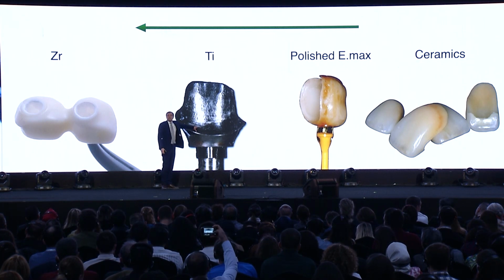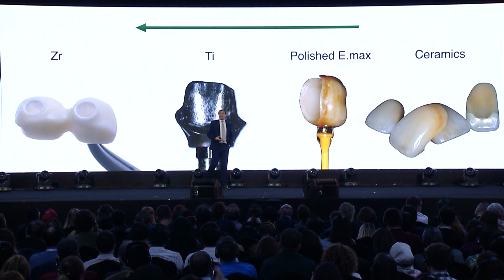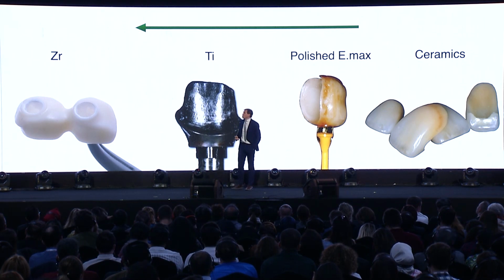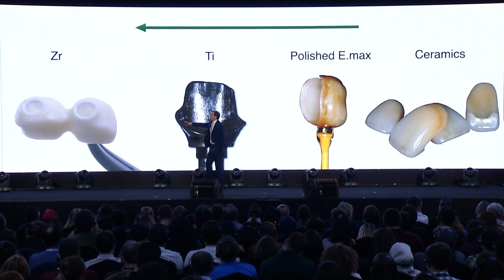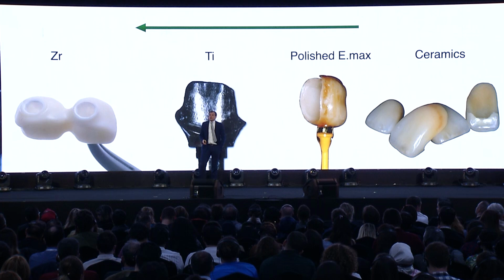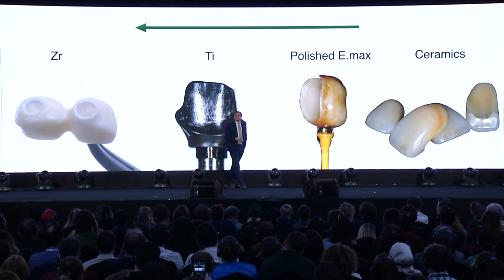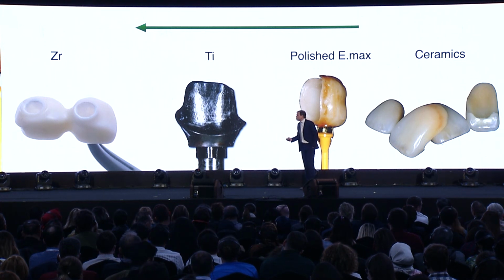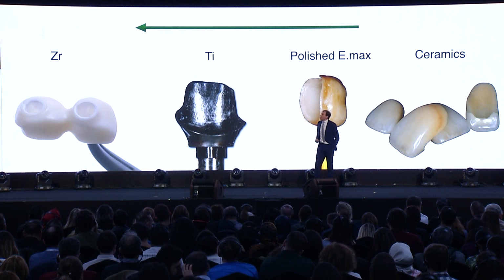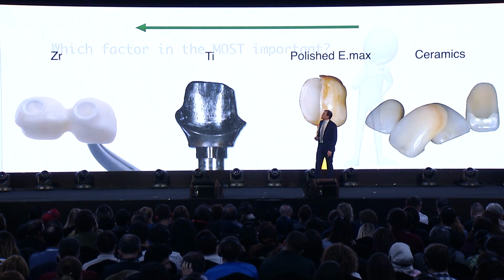Now, what about titanium? Of course, titanium develops adhesion to epithelium. However, it is less strong than adhesion to zirconia. And from the other side, we did not really test titanium so much. So that's why I think that still zirconia would be my choice number one.